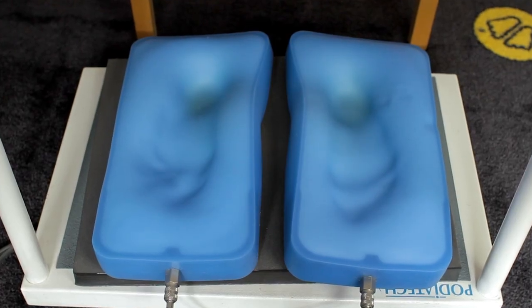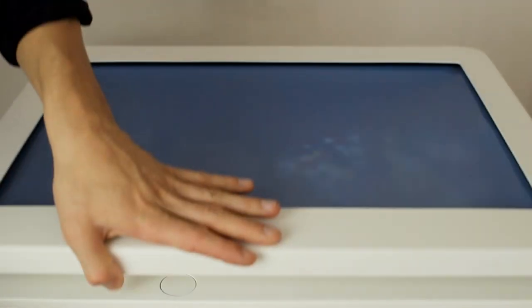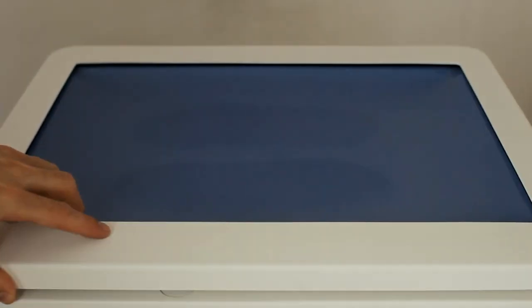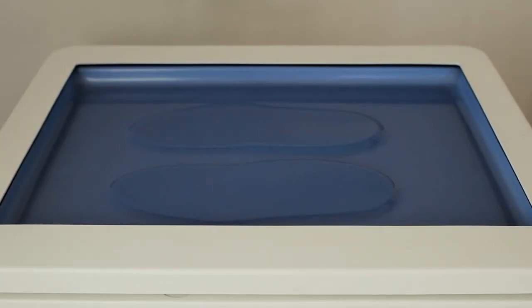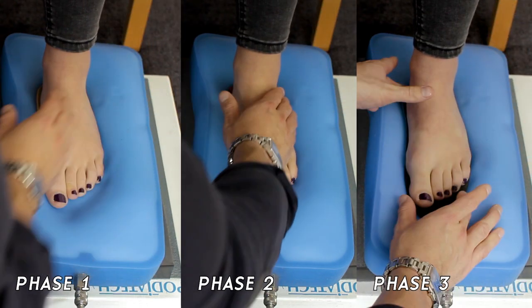Once aligned, different materials and layers are prepared for each of your footprints. They're warmed up and softened, ready to be precisely molded to your feet.